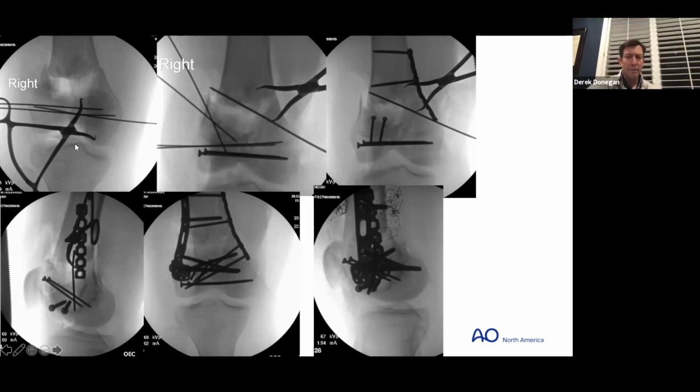But I think the principles, though, Matt, are similar, right? And so I think that's important. So from what I'm hearing, why you decided to use two plates here is you felt you had a better read on that medial side, which was going to allow you to build your articular segment and that read back to your metaphysis. So that was your decision. So what did you do for this person post-operatively? How do you manage this person in the post-op period from a weight-bearing perspective to range of motion?